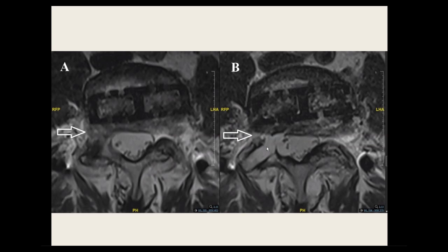And I think the point to make here is that I always caution patients with complex pathologies, such as those who've had previous laminectomies or fusions, that they have a higher risk of spinal fluid leak. But I would not recommend in a case like this converting to open to try to repair this. I think the chances of a spinal fluid leak happening after an incidental durotomy is very low.